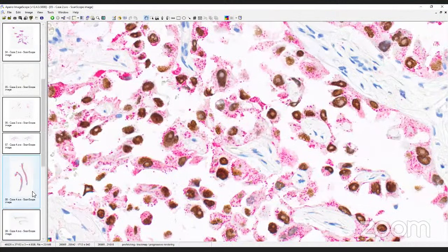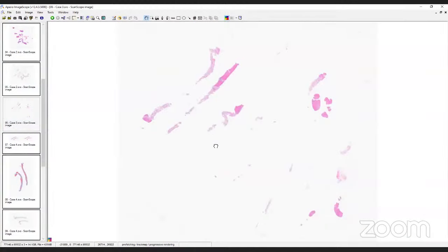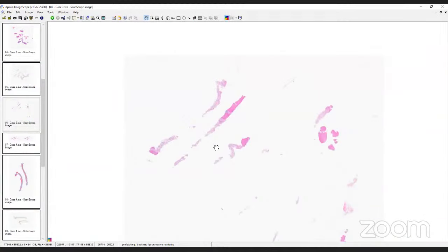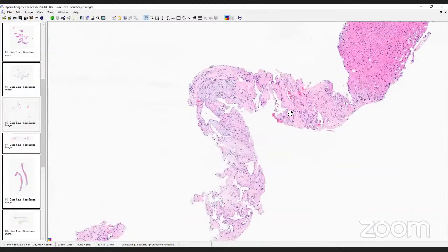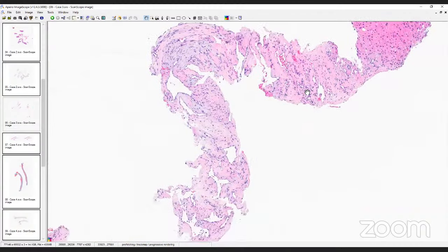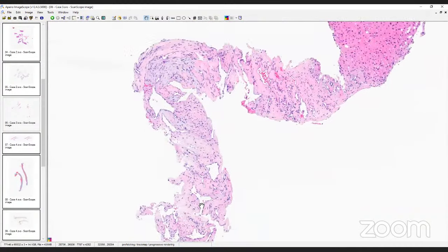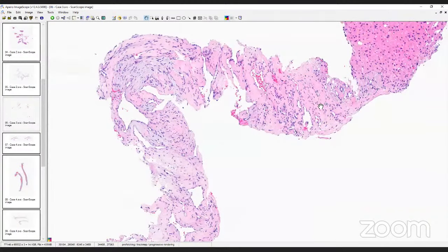And this is the biopsy. So it's highly fragmented, very thin cores. That's the first thing that makes you hold your breath because you're like, I hope we can make a diagnosis. These are not the best cores on earth. And then I look at it and I heave a big sigh of relief because A, I can make the diagnosis, and B, it's extremely good for the patient because this is, as you would have all recognized, a cavernous hemangioma.